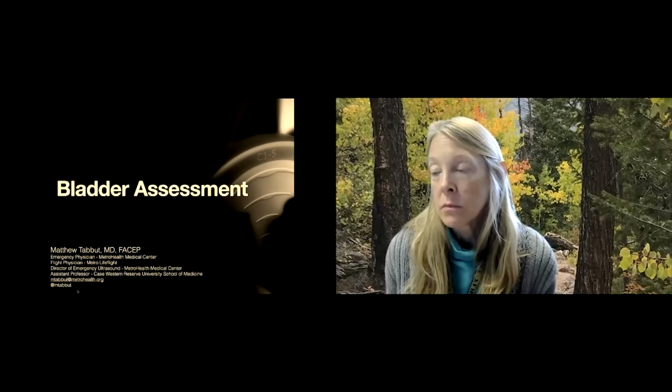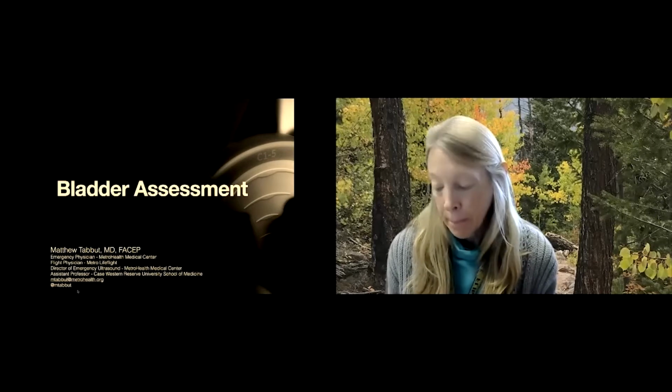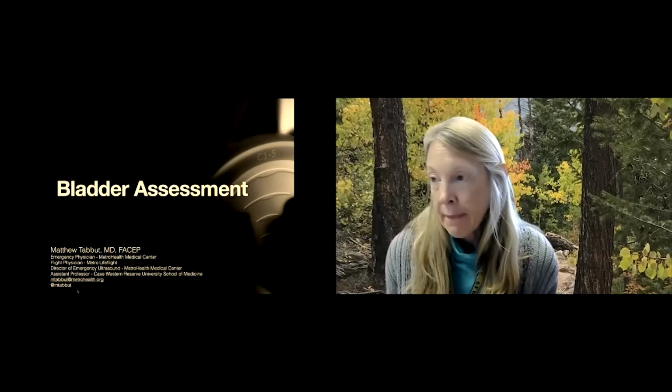And when we do our QI, this is definitely a frequent study that's done, based on the numbers that a lot of our faculty do, because it's easy. It's some pretty immediate and actionable information. So I think this will be helpful, and an interesting change of gears and topic. Without further delay, let's dive into the bladder and talk about bladder assessment and how we can use this in our practice. That's the topic of today's conversation.